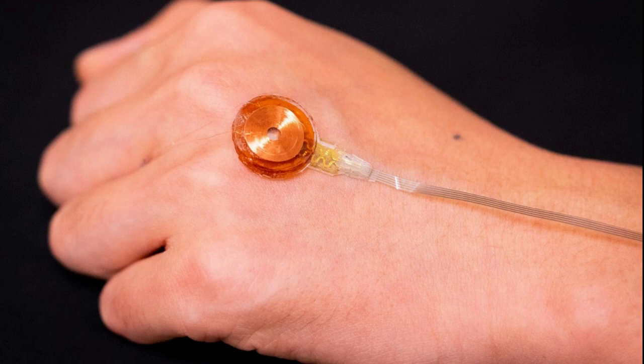The team then conducted clinical studies on patients with skin disorders with their newly invented electromechanical device. The results indicated a potential for accurate targeting of lesions associated with psoriasis, showing the practical medical utility of the device. The data produced can assist in diagnosis, treatment, tracking, and disease monitoring, particularly for skin-associated disorders such as skin cancer, as well as in aspects of aesthetic dermatology and of the recovery from surface wounds.